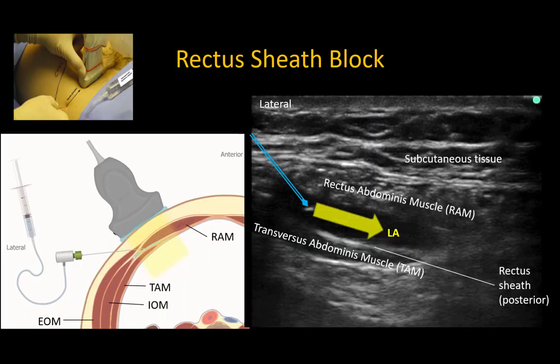For single injection blocks, an in-plane approach from lateral to medial is recommended. Note how lateral the entry point is due to the width of the rectus abdominis — this allows it to be performed even in the presence of wound dressings. Look for local anesthetic spread lifting the muscle away from the hyperechoic line of the posterior sheath.